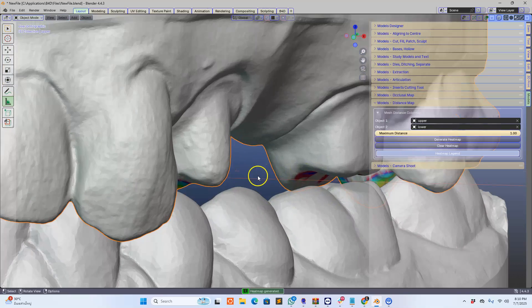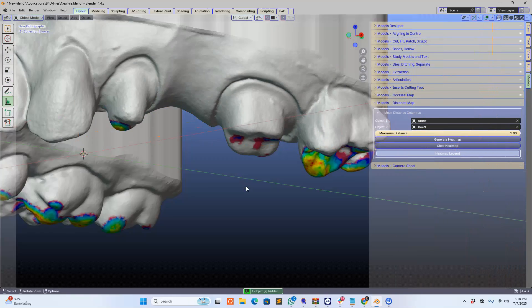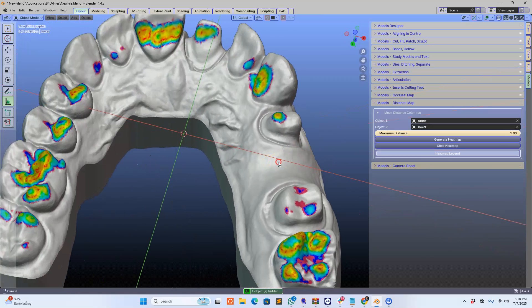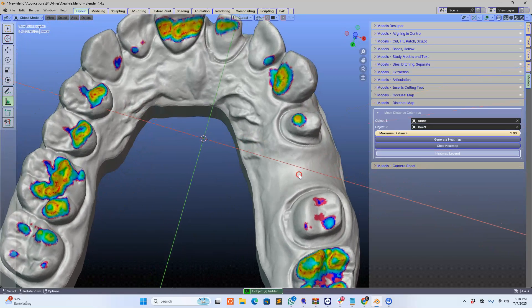So here we've got a heat map that's generated. Let me hide the lower model and we can see it's absolutely stunning.